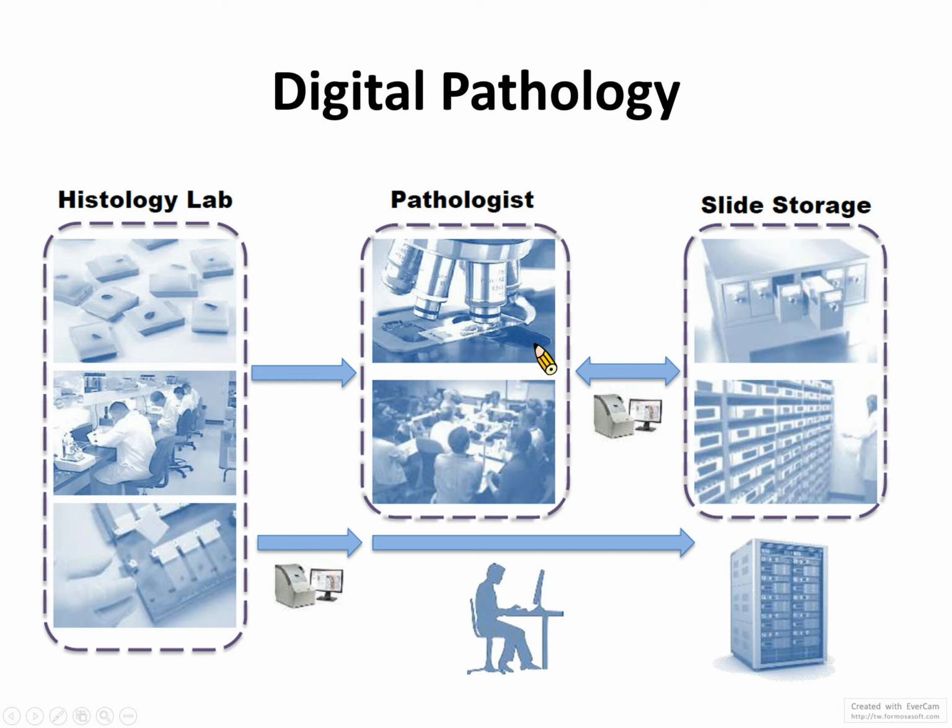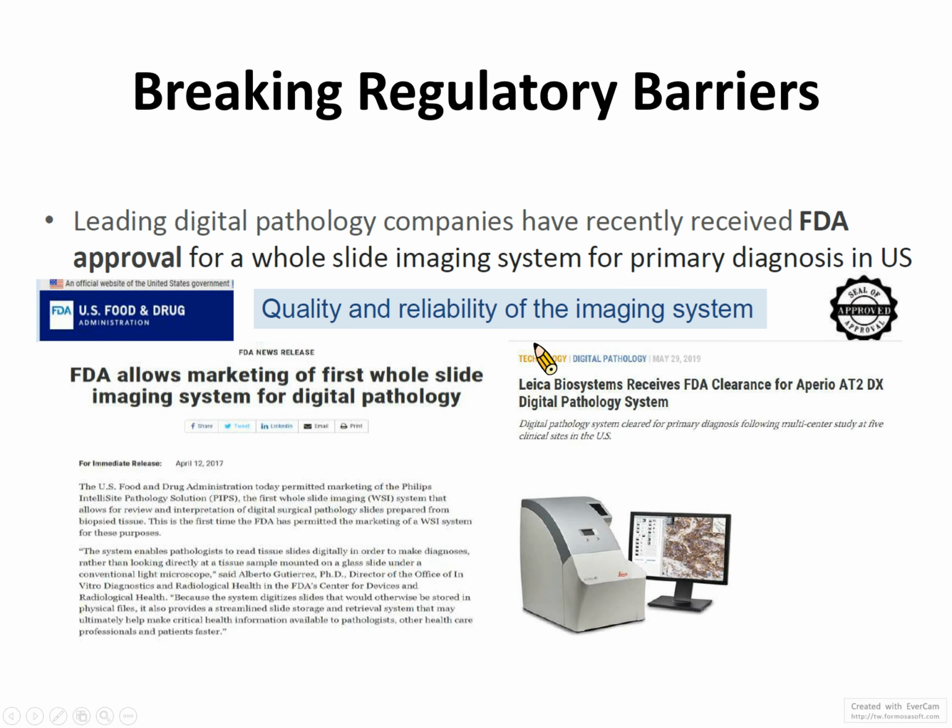If you digitize these pathology slides, you can ensure the images will not degrade over time compared to the physical slides. So this is one of the advantages of digitizing pathology slides.